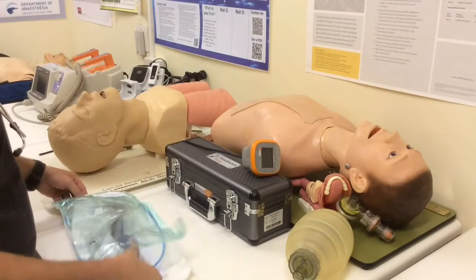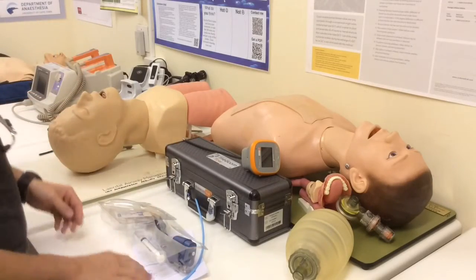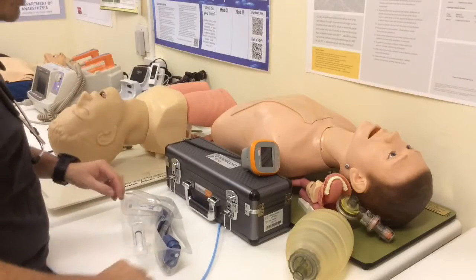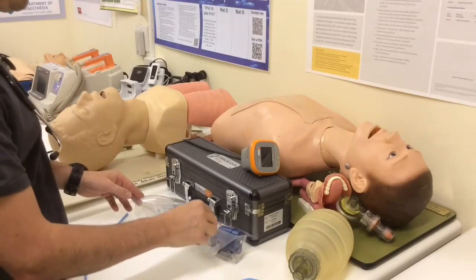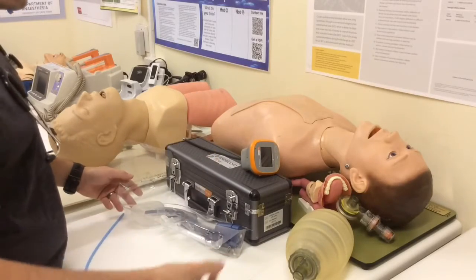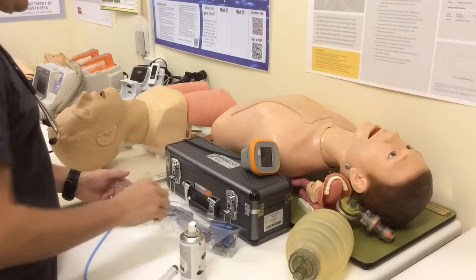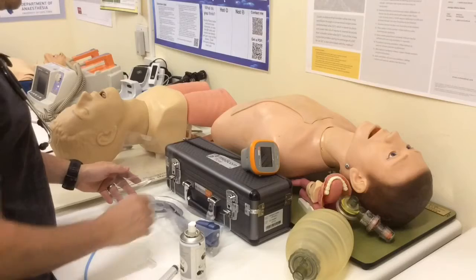Inside the blister pack you get basically everything that you need for the patient except an endotracheal tube. So there's some instructions if you want to read them. You get quite a nice bougie, which I'll show you how that fits in later. You've got a syringe to inflate your cup. You've got some lubricant. I'm going to substitute that for some mannequin lube in this instance. And you've got an elbow connector. That use will become clear in a moment.